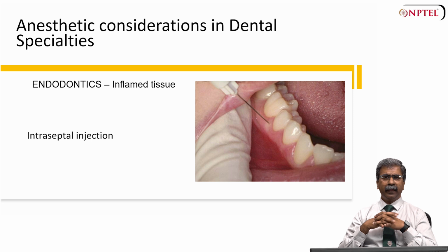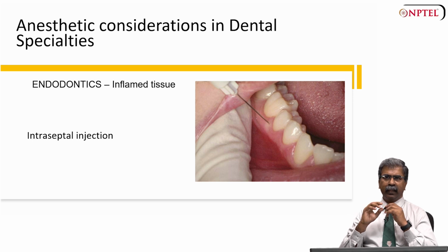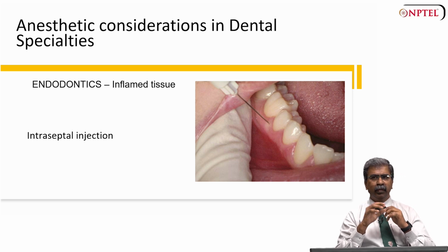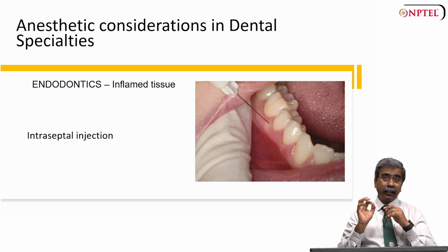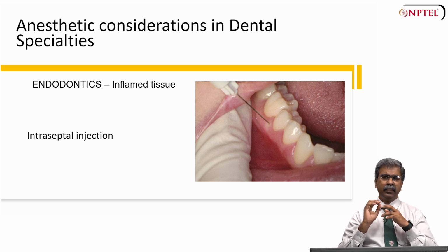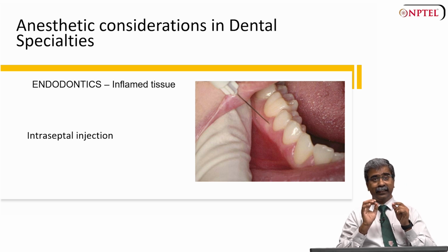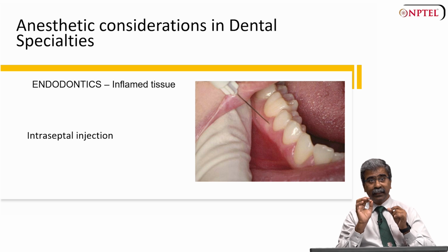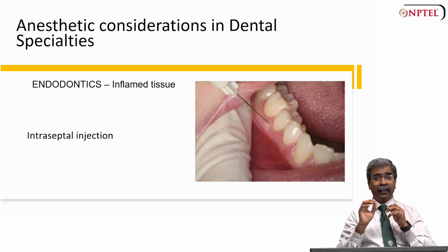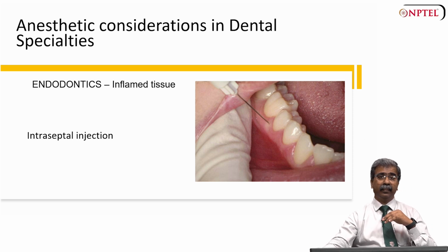Intraseptal: soft tissue anesthesia by local infiltration. A 27 gauge needle can be used in the intraseptal bone, and you just require 0.2 cc of anesthetic. There will be resistance when you inject intraseptally, and you can see the blanching of the intraseptal region.